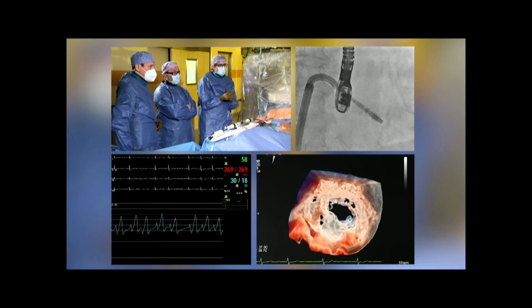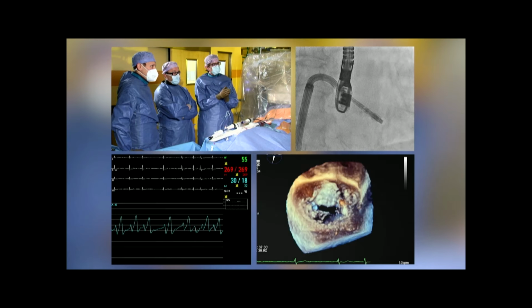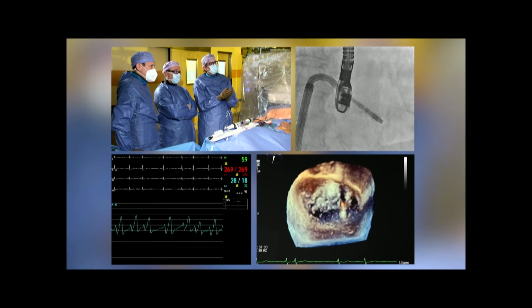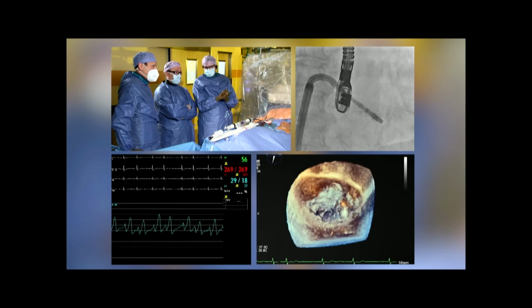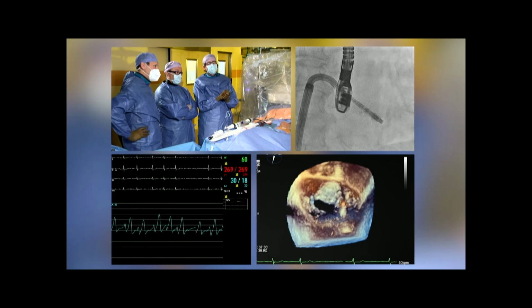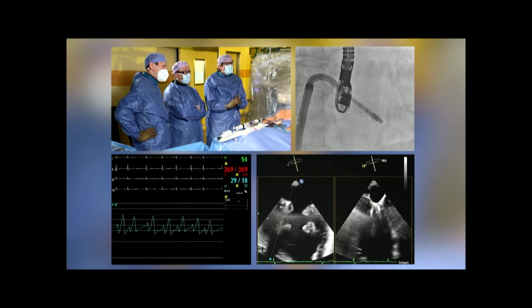May I suggest the following? We do another breath hold. We open the device. We will not lose position. And then we can bring up the clasp very gently and then try to be a little bit more medial. What is your rationale to do this? Just to explain it to the audience.